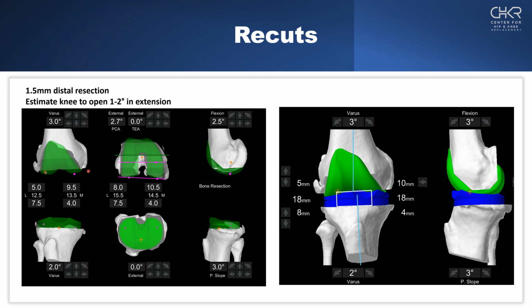So I'll take 1.5. So I will gently raise my joint line from 8 millimeters to 9.5 millimeters and then make the distal femoral cut. And again, remember, I don't have to do it on the tibia because I have a sufficient amount of space in a balanced extension gap. Okay, so then I'll make those cuts, and then now I can see I'm at an 18-18. So I've opened up my gap, I'm back to a neutral alignment, and I have symmetry back to where I want to be in my target.